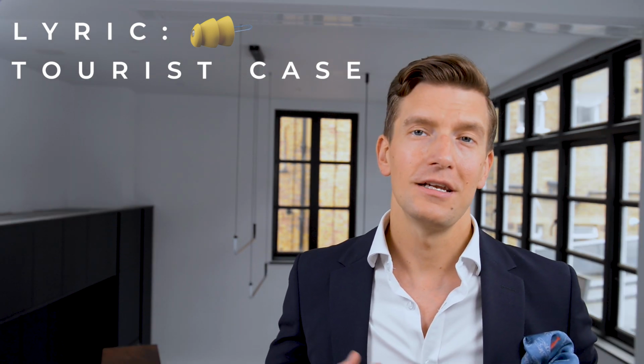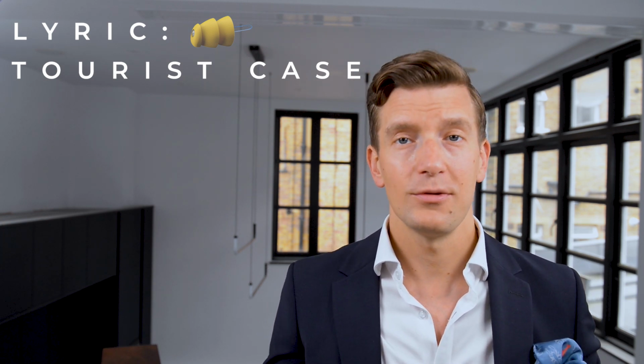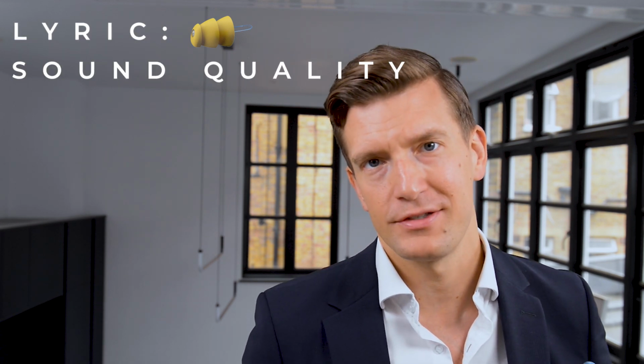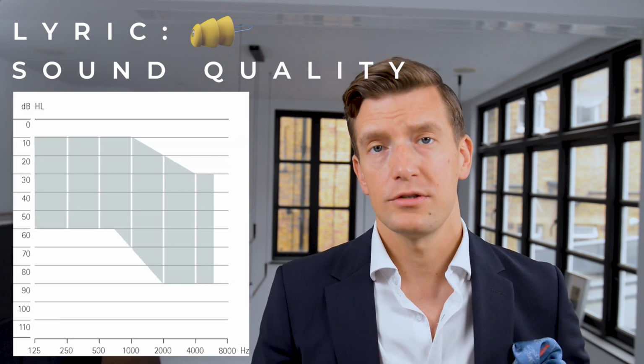As you can tell, I think that Lyric is great from a convenience point of view, but there are a few lifestyle choices that you just have to be aware of if you're interested in wearing Lyric. Of course, I haven't even spoken about how it works from a hearing point of view yet. And again, I'm pleased to say that there are a lot of positives. It's suitable for mild to severe hearing loss, so if your hearing loss falls within this fitting range, then it could be suitable for you.